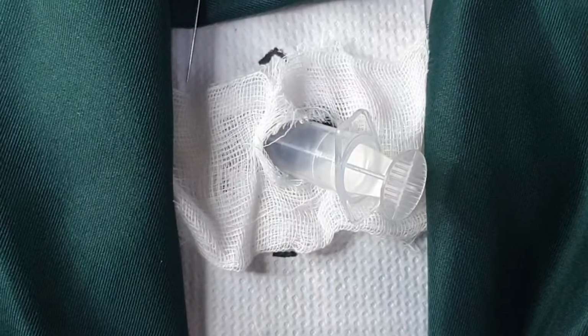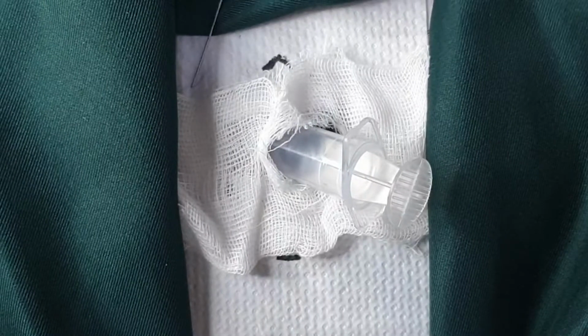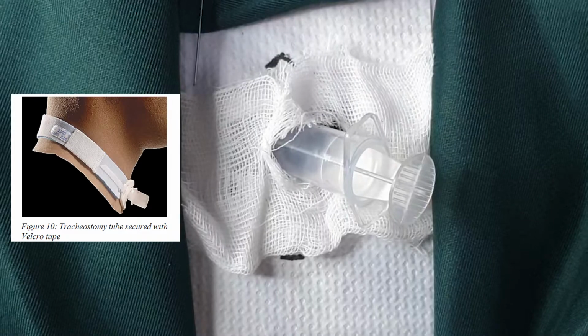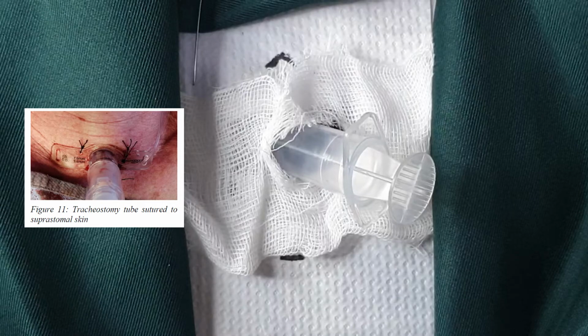Securing the tracheostomy tube. Thread tapes through the holes in the flanges of the tracheostomy tube and pass them around the neck. Tie them with the neck flexed. The ties should be tight enough to admit no more than a single finger under the tape. Suture the tracheostomy tube to the skin for the first few days until maturation of the tracheocutaneous tract.